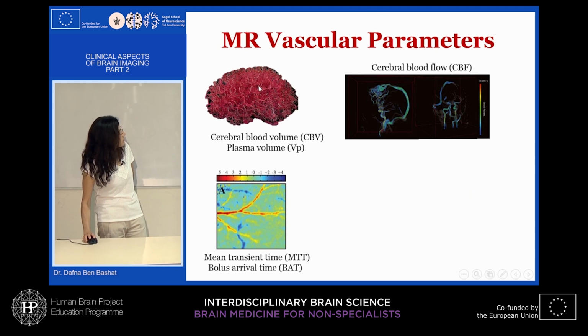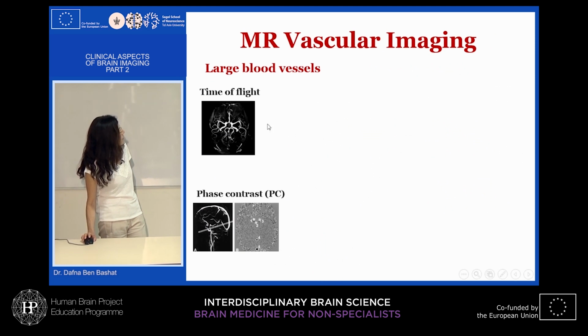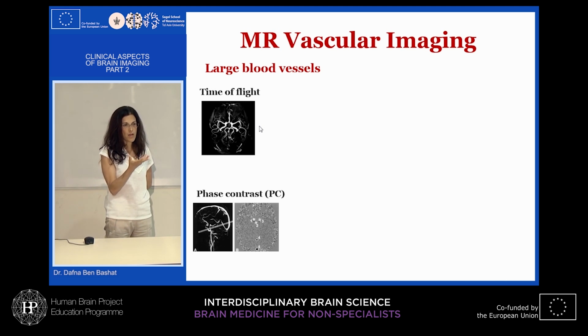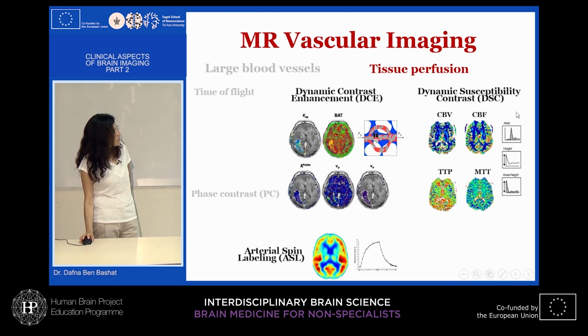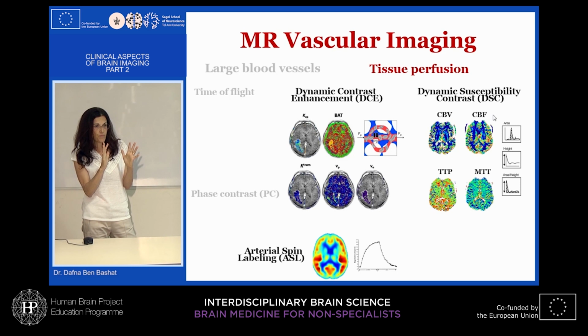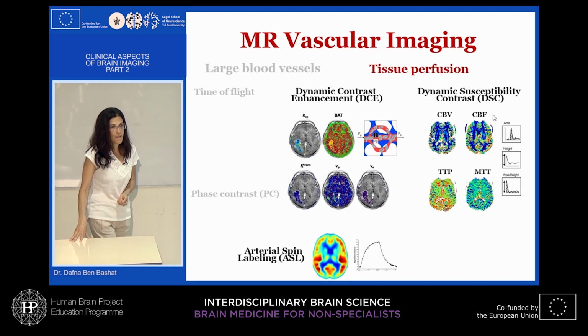Those are EPI methods. When we talk about DSC, sorry, let's even go here. Here we have 0.5 millimeter by 0.5 millimeter by 0.5. It's reconstructed, but the contrast shows you only large blood vessels. This is an EPI, so it's 2 by 2 by 5. This method we can improve. It's always a question: when we play with high spatial resolution, it's at the expense of the temporal resolution and vice versa. So it's always a trade-off.